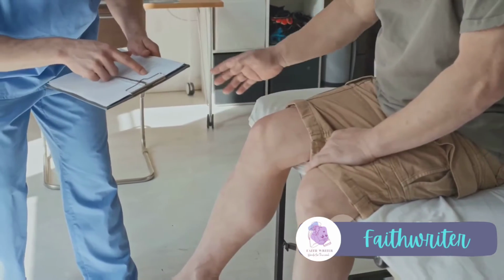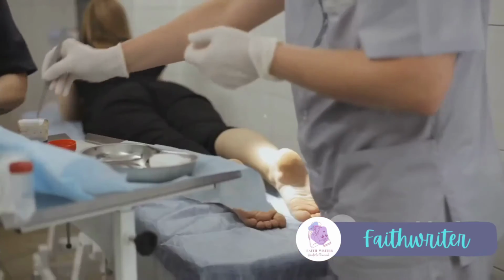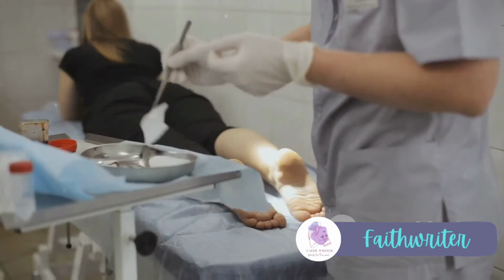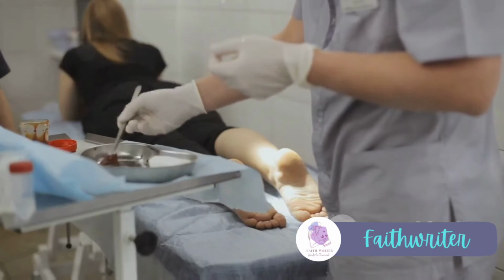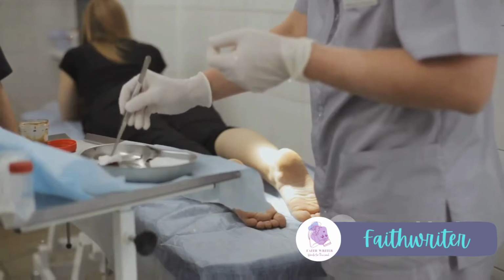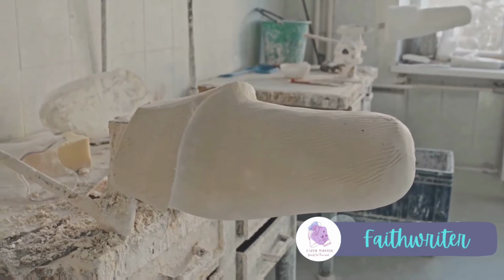AFOs are not off-the-shelf products. They are custom creations, tailored to fit an individual's anatomy. This customization process kicks off with taking precise measurements of the patient's leg and foot. This task is usually performed by a certified orthotist. Following the measurement, a plaster cast is traditionally used to create a mold of the patient's leg and foot.